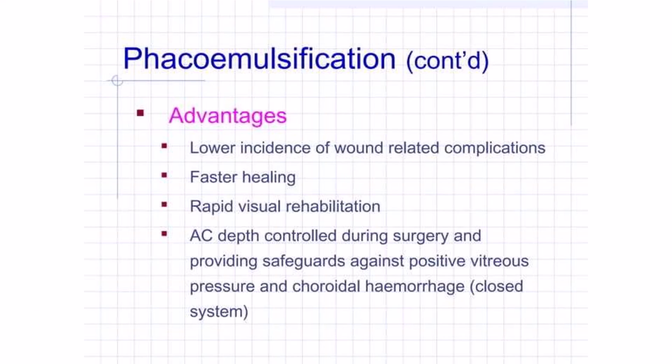So the advantages are there are lesser wound-related complications, faster healing, better rehabilitation, and the AC is always maintained because there is a constant irrigation from the phaco probe.